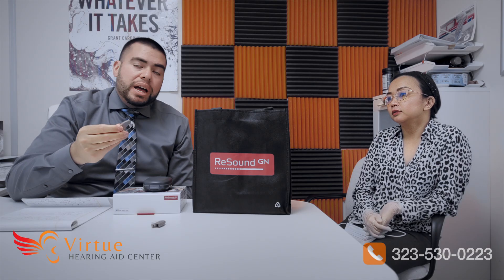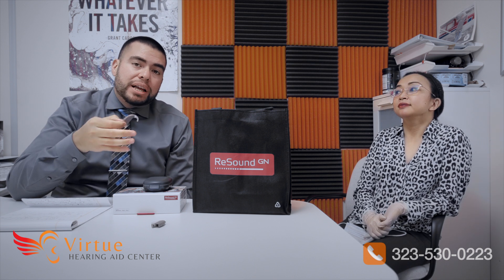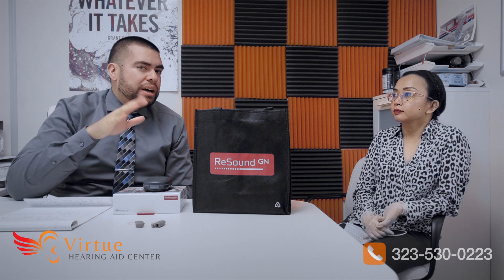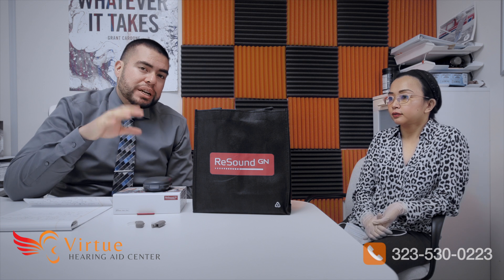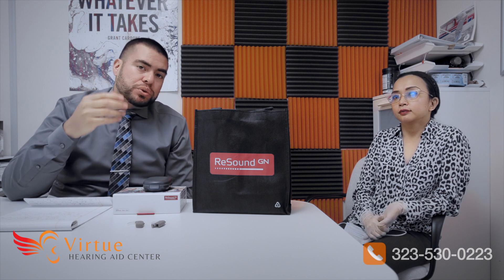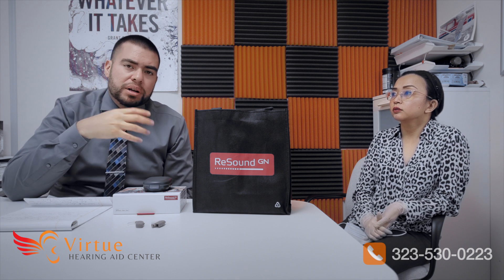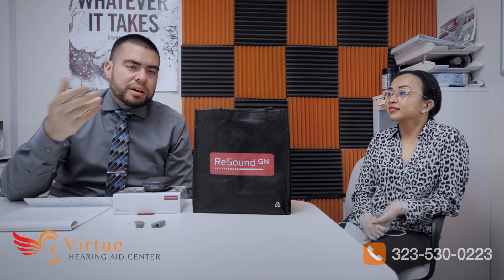These also have Bluetooth connectivity, direct to iPhone and Android users. With iPhone you need a 5S or newer, and for Android users you would need Android 10 or newer to connect directly. If you have an older phone, we'll talk later about some accessories that can make it compatible.